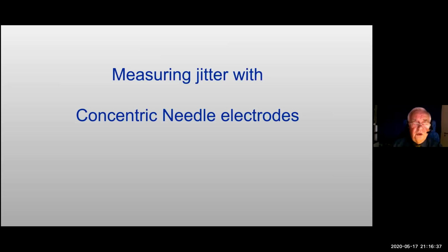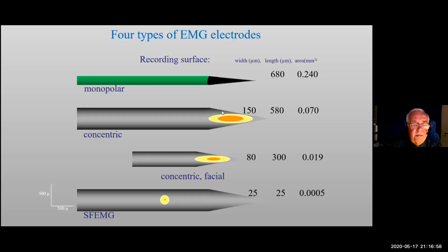So that was not so expensive. But now, if we are not allowed, I mean, we cannot throw them away, we have found that the smallest so-called facial needle, the small concentric needle electrode, can be used. It's a little different, but I will show the principle here.